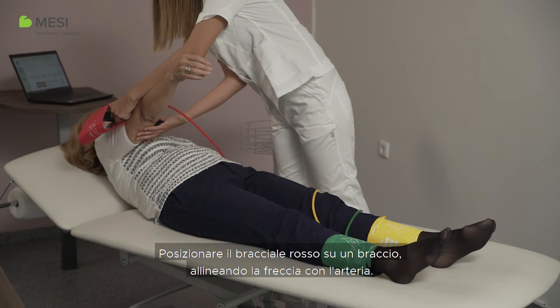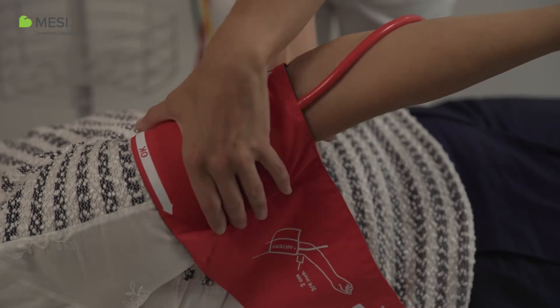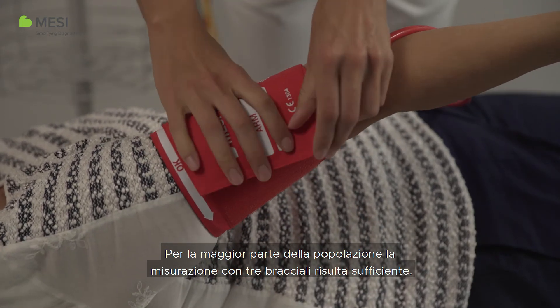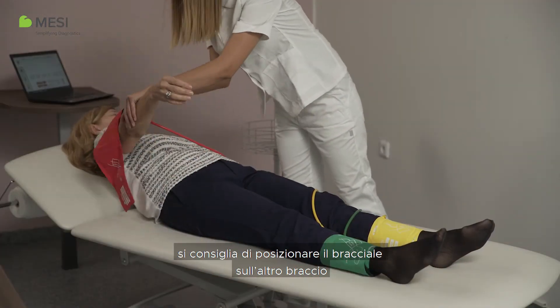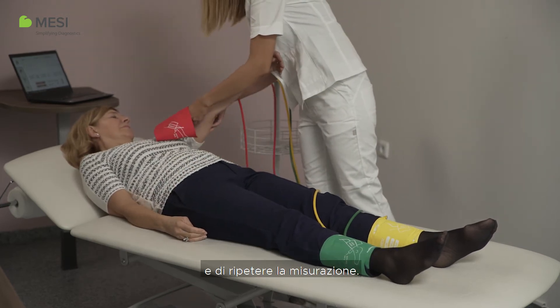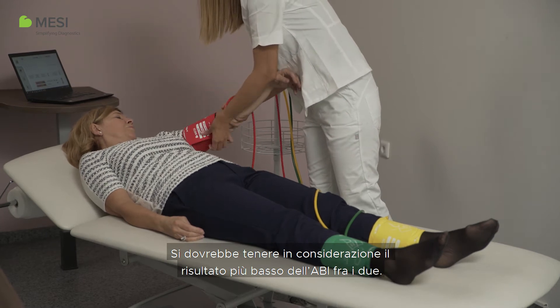Place the red cuff on an arm, aligning the arrow indicator with the artery. For the general population, performing a three-cuff measurement is sufficient. When a difference in the arm blood pressures is suspected, it is advised to place the arm cuff on the other arm and repeat the measurement. The result considered should be the lower ABI of the two.